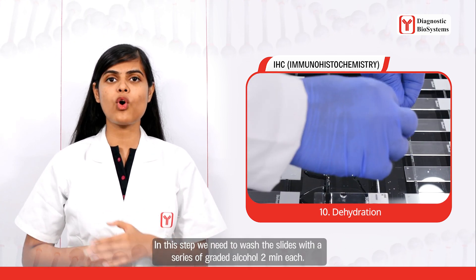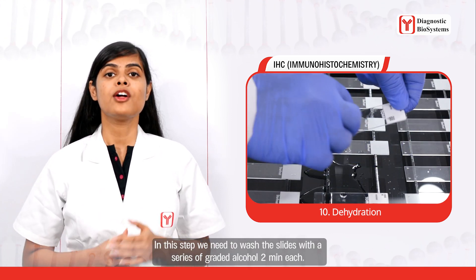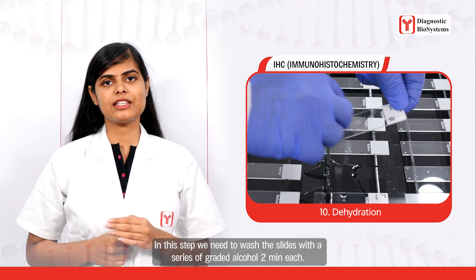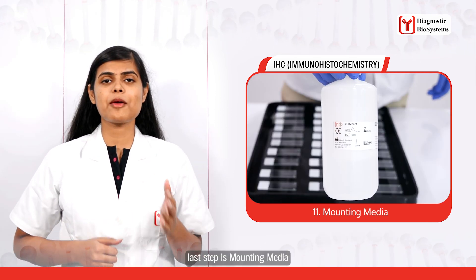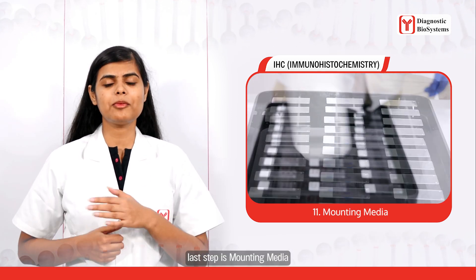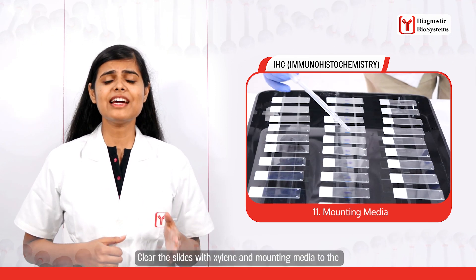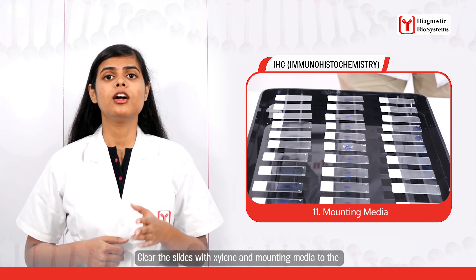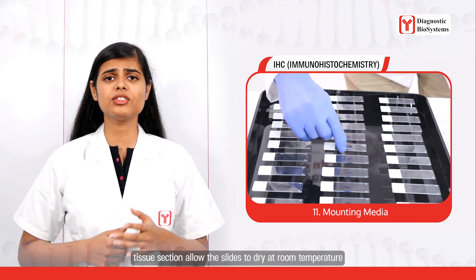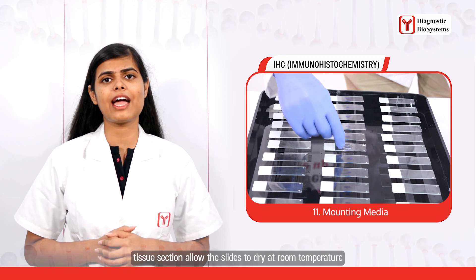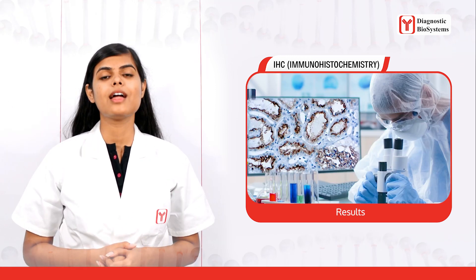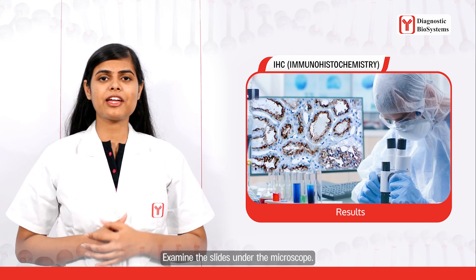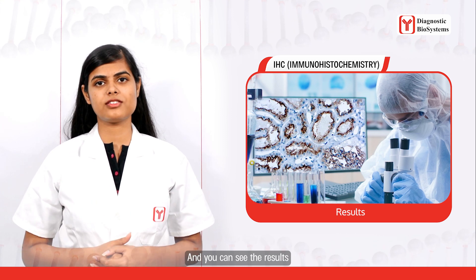The tenth step is dehydration. Wash the slides with a series of graded alcohol, two minutes each. The last step is mounting: clear the slides with xylene, add mounting media to the tissue sections, and allow the slides to dry at room temperature. Examine the slides under the microscope to see the results.